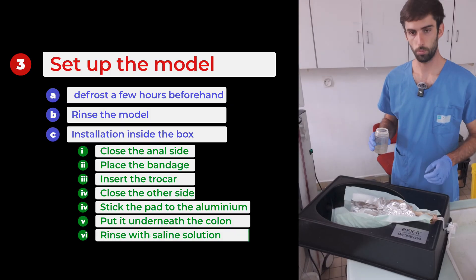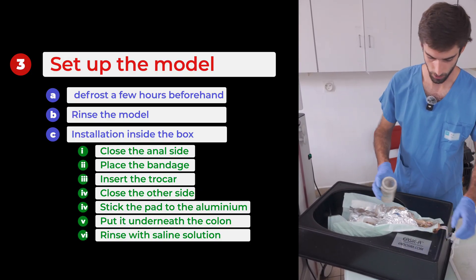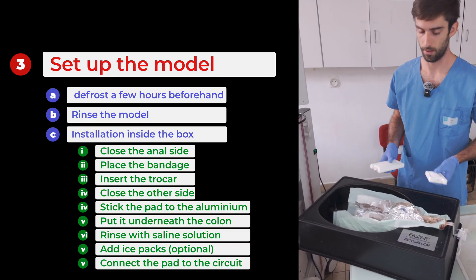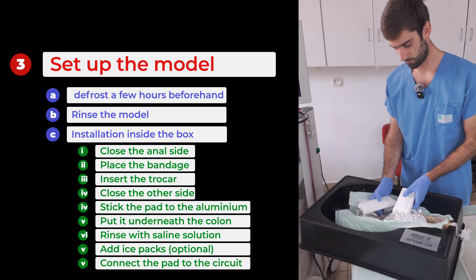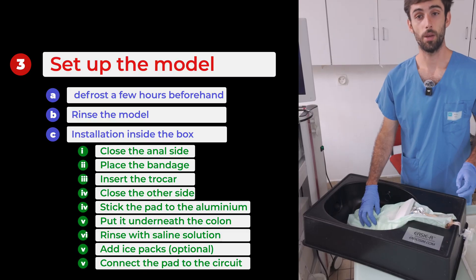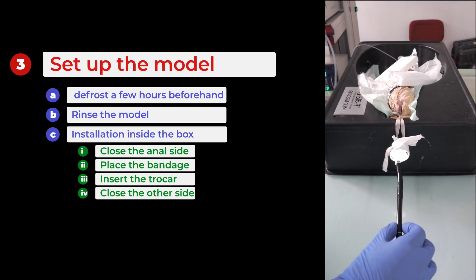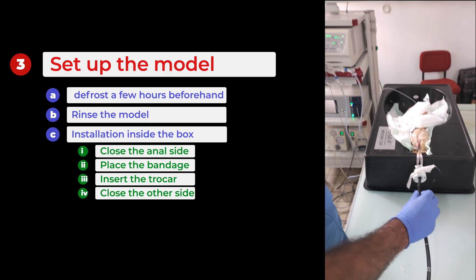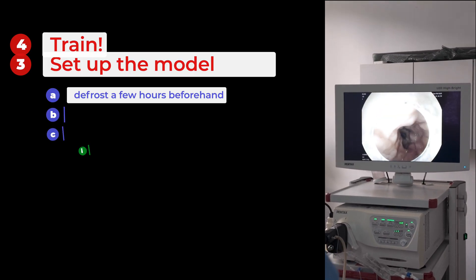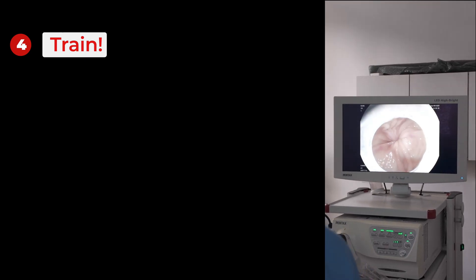At this stage, we recommend slightly moistening the colon to preserve it and to ensure conductivity throughout the day. A little tip: if you have them, use ice packs to keep the colon cool if you're planning a long day of training. Now we are ready to begin introducing the endoscope into our anatomical model through the trocar. We can see that the colon is perfectly clean and we'll be able to go all the way to the anal pole. We can start dissecting at this level.